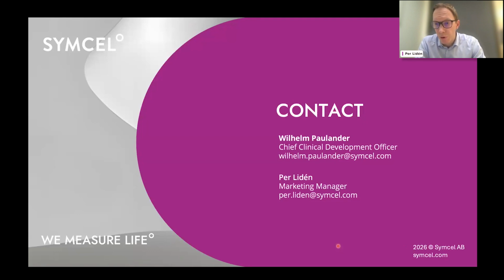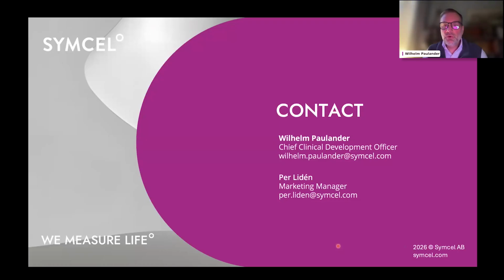Regarding the safety margin and time to detection, has Symcel tested cell therapy products exceeding the claimed 3-day time to detection when considering the safety margin? At 10 CFUs for C. acnes, or below 10 CFU as we do the testing of product, we have been able, for all products tested so far, to have a detection time below 72 hours.